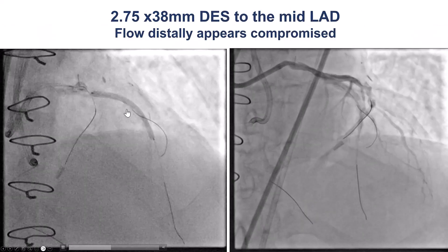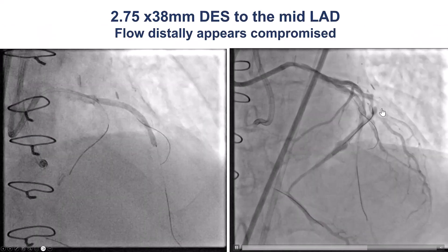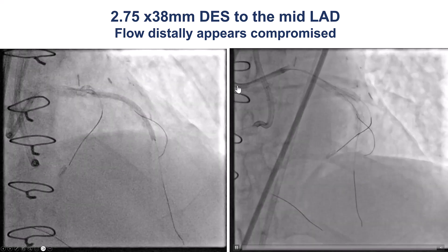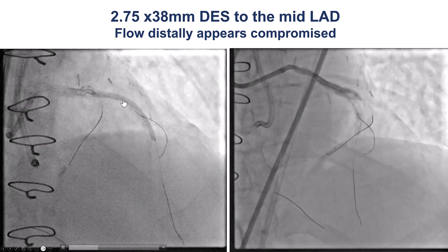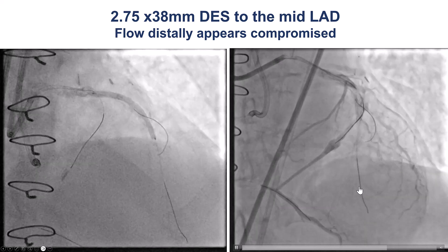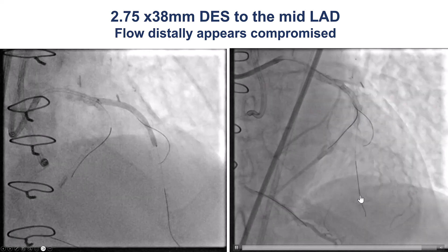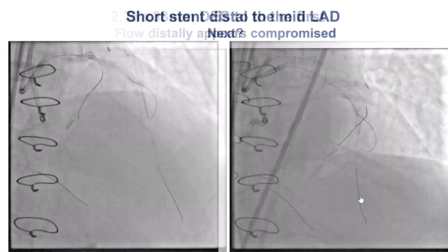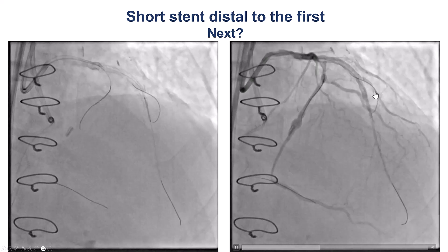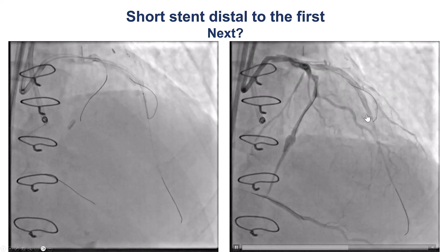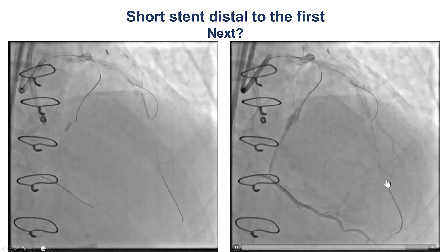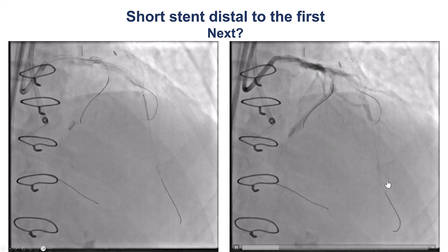We placed a stent in the circumflex. And then we decided to stent along the LAD CTO. The problem is, after we placed the stent, there was very poor flow distally. Maybe it was a distal dissection, so we placed another stent. But again, not very good — very poor flow into the distal LAD.